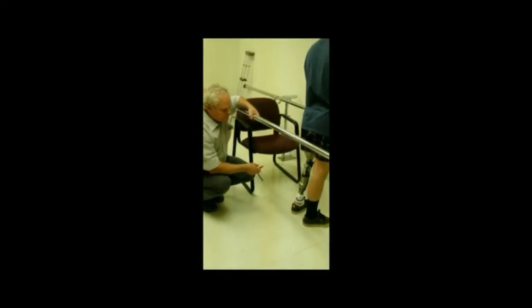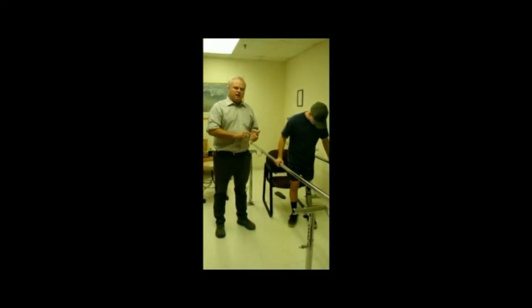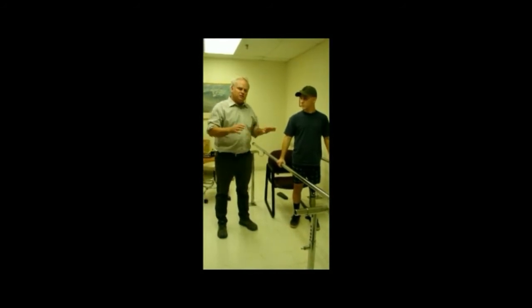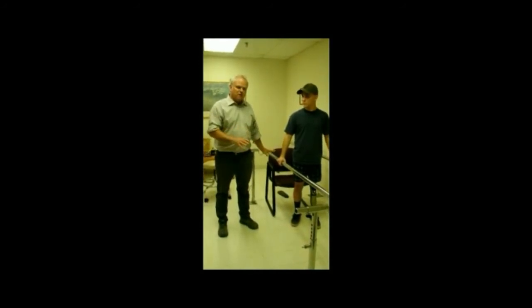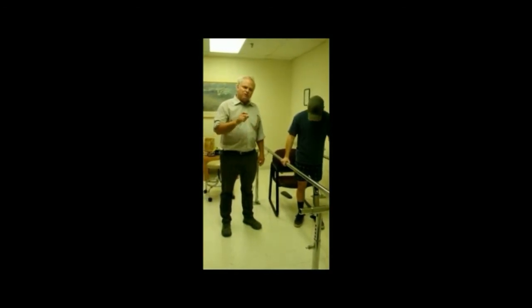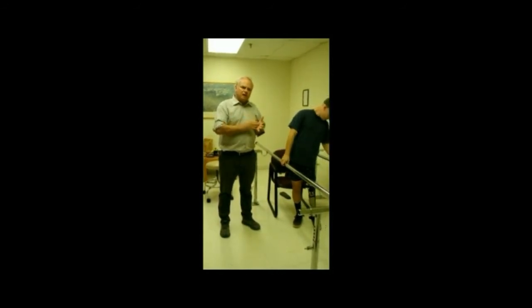In the future, when he gets to know the knee, I'm going to fine tune going down ramps. I'm going to fine tune the yield in particular. I want the yield to work just right. And more importantly, I'm going to fine tune where the toe load is, the big screw in the back, how that adjustment is, because that's timing.